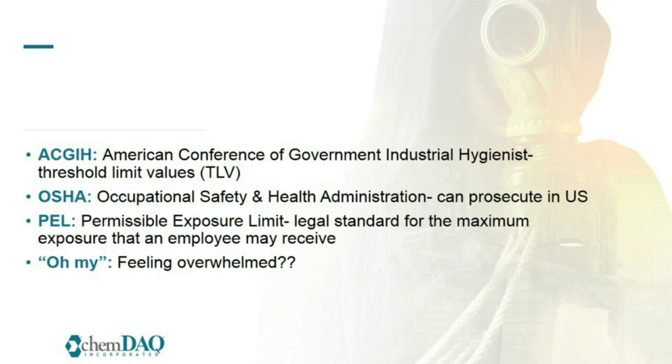well as the Cal OSHA PEL limits. OSHA recommends following these other exposure limits if they are at lower concentration levels. And finally, oh my, I don't know about you, but if the TLVs and the PELs and the OSHAs and the ACGIH TLVs haven't gotten you confused, I don't know what would. This information can flat out be overwhelming for SPD leaders, so it's vitally important that we take the time to understand what they are talking about.